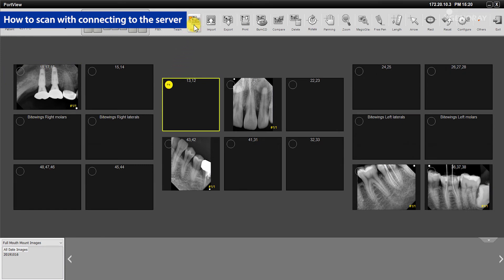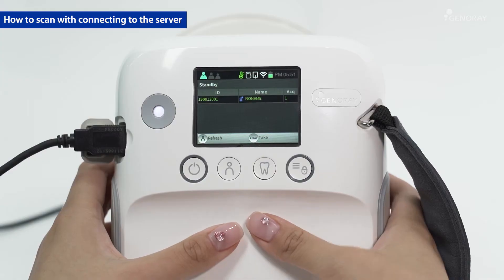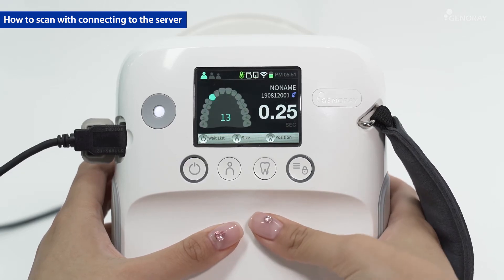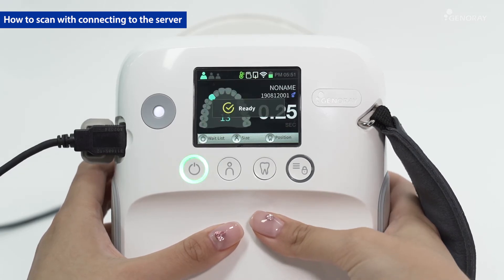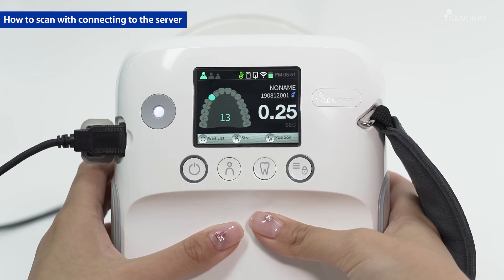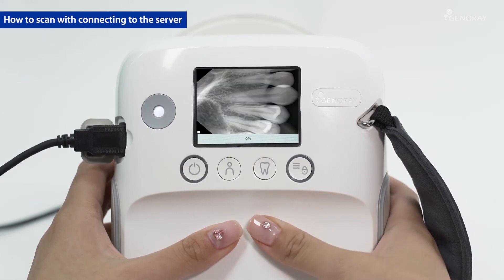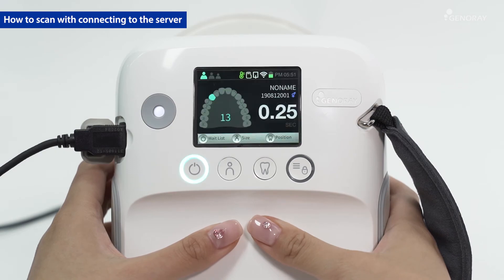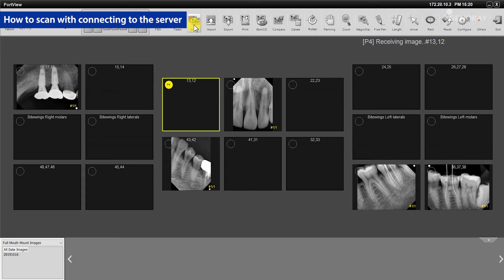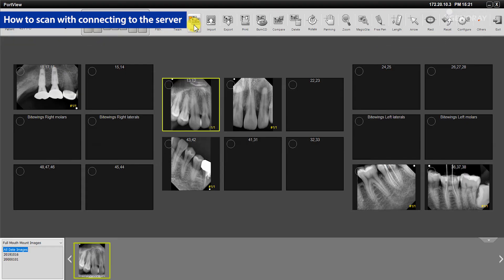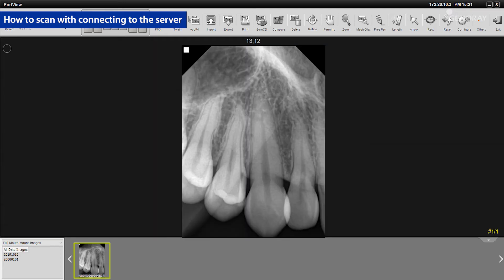Select a patient to scan from the standby list. The exposure time is set according to the tooth number requested. Position the beam limiting device exactly where to expose and press the X-ray button. You can have the transferring of your images to your PC automated by setting the preference in the settings window.